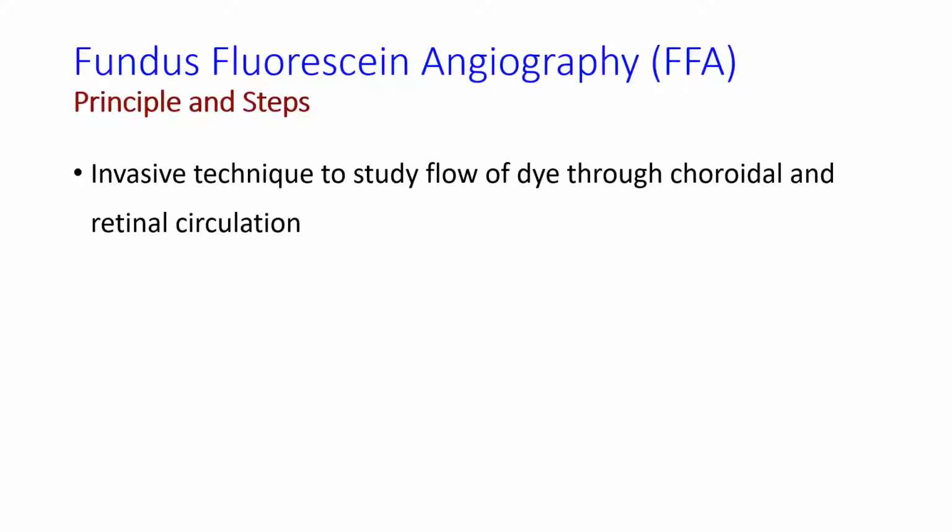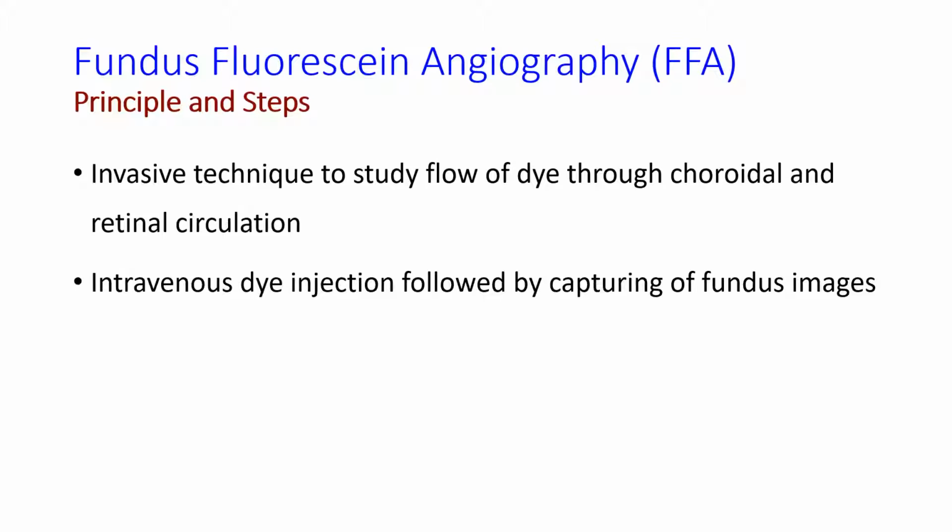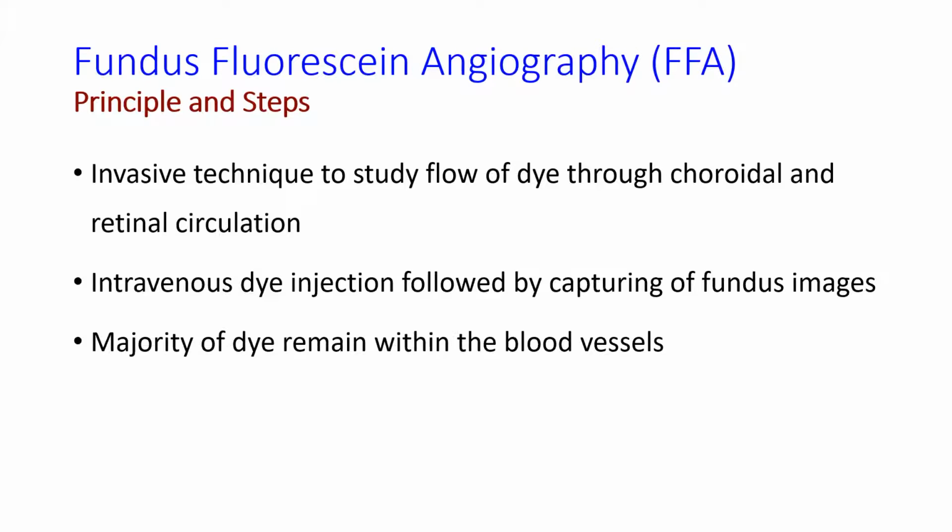Fundus fluorescein angiography is an invasive technique to study the flow of sodium fluorescein dye through choroidal and retinal circulation. The dye is injected intravenously, followed by capturing of images using a fundus camera. The majority of the dye remains within the blood vessels in a normal individual because of the integrity of the blood-retinal barrier.